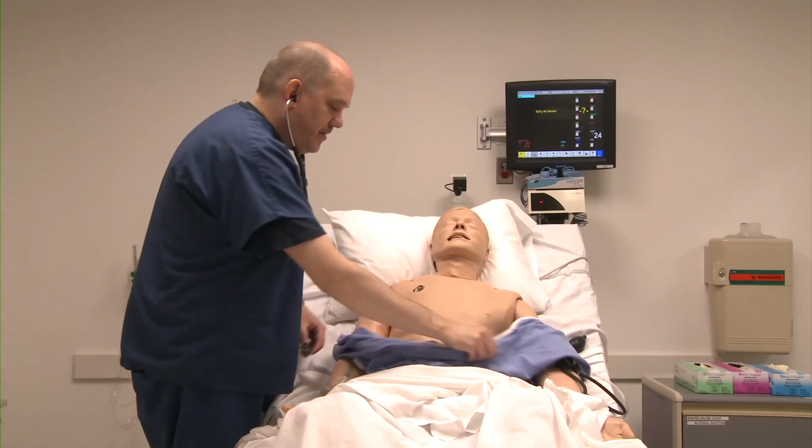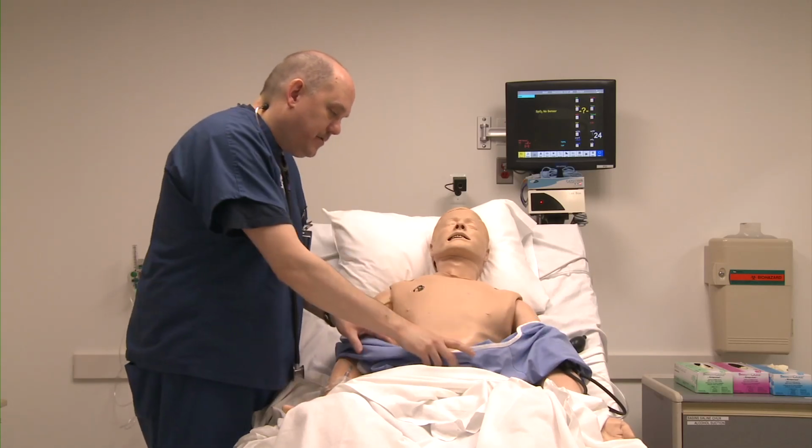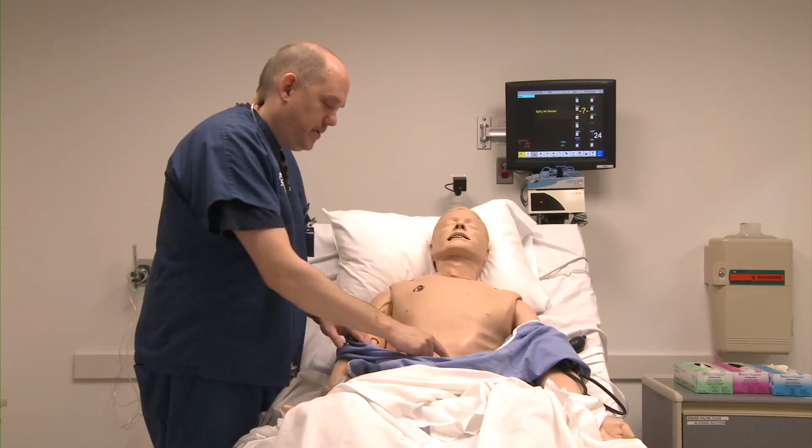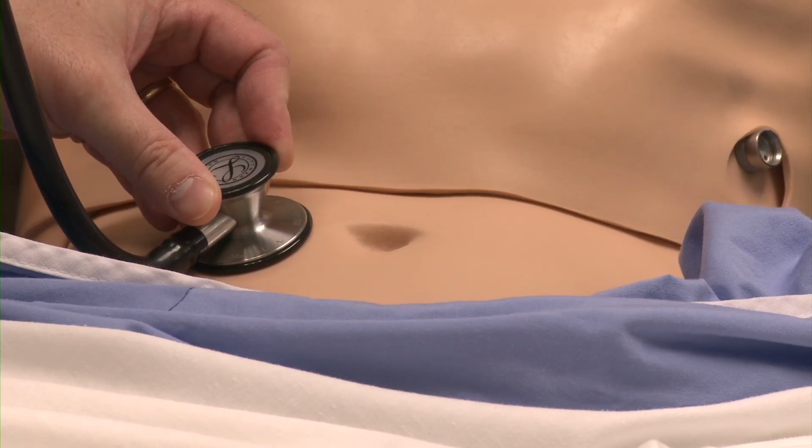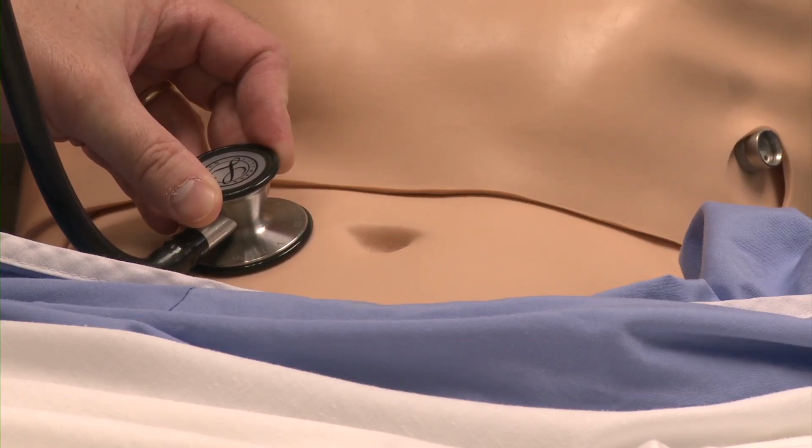To listen to bowel sounds, we want to pull down the gown, identify the belly button, and the speakers are on either side of the belly button.